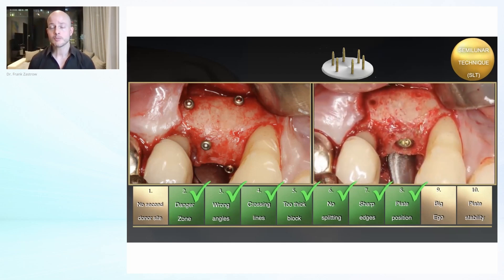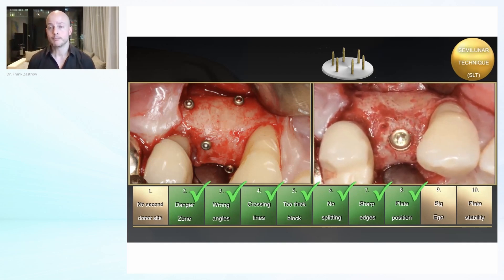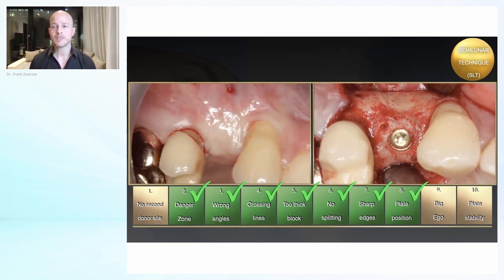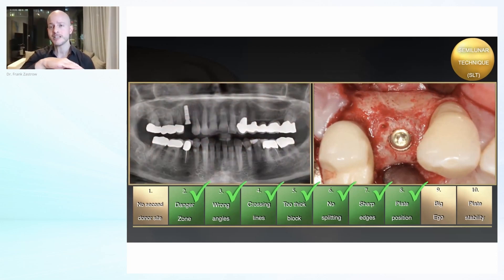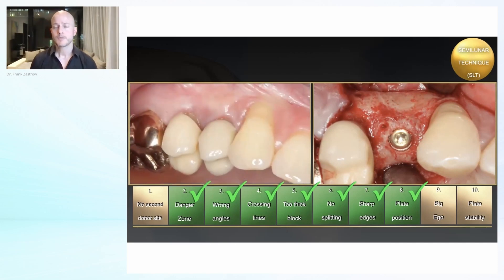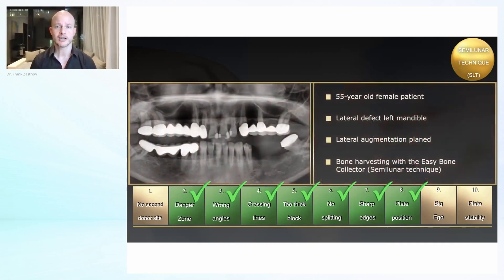It's still a vertical bone augmentation. Place the implants at least one and a half millimeters deep. After 10 years, we face some bone resorption, but compared to all other materials it's very, very small — on average 0.75 millimeters, less than one millimeter. Second stage surgery is done with the apical reposition flap, one of eight techniques from our education. It's a nice technique for shifting the keratinized mucosa to the buccal side — everyone should have this in their toolbox. And the final result: simple, straightforward case, prosthetically not very challenging.